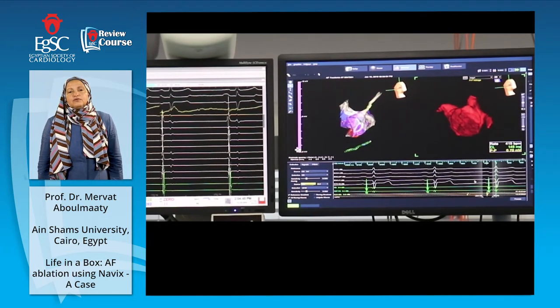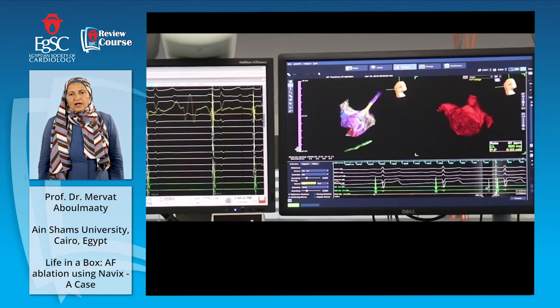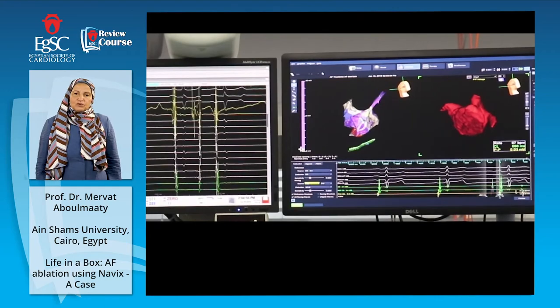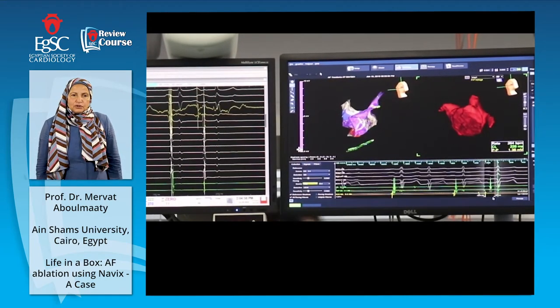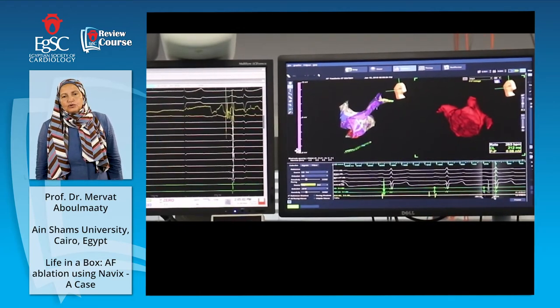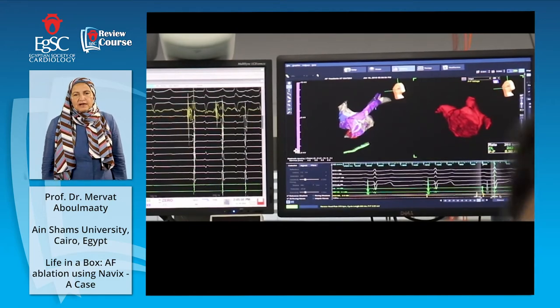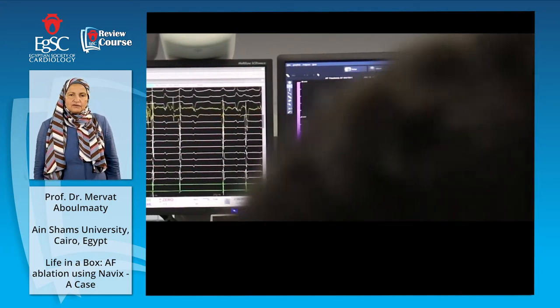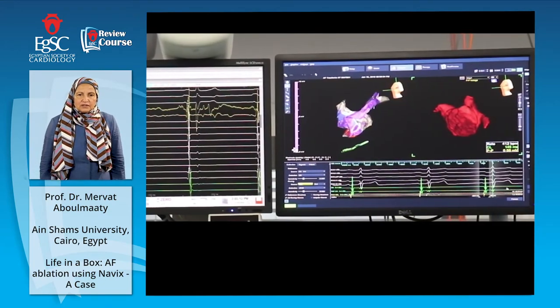Now I will map with the ablation catheter. It is in the left superior pulmonary vein, as you can see here. I am moving into the vein to get a good volume. Yes, and I'm going down, and when I reach the ostium, I mark the ostial orifice because we don't want to make ablation near the ostium. We make ablation outside the ostium. We make WACA, wide area of circumferential ablation, outside the left side veins and outside the right side veins.